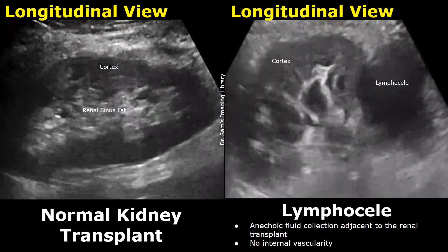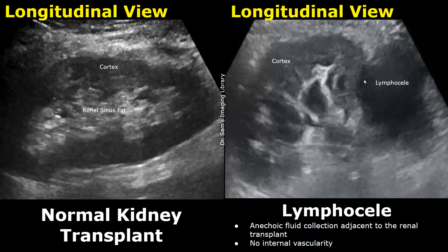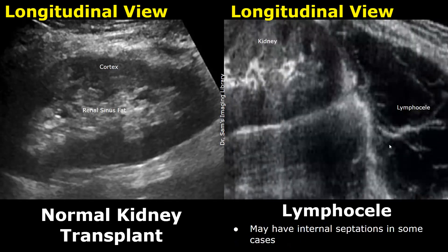Here is another example of a lymphocele. We can see an anechoic fluid collection adjacent to the renal transplant, and there will be no internal vascularity on color Doppler. Some lymphoceles may have internal septations, as we can see in this example — this fluid collection has internal septations.